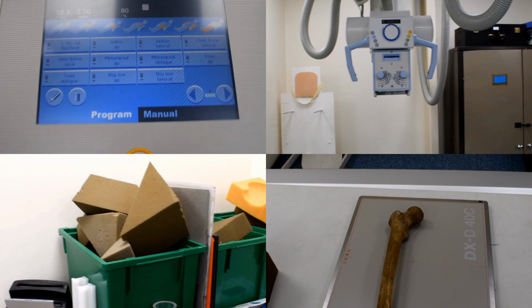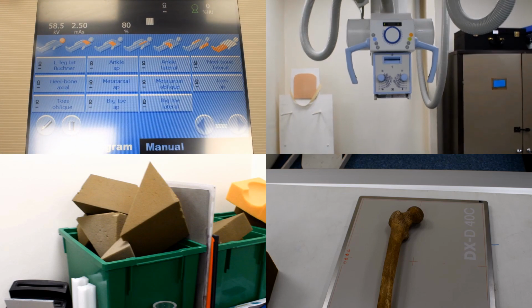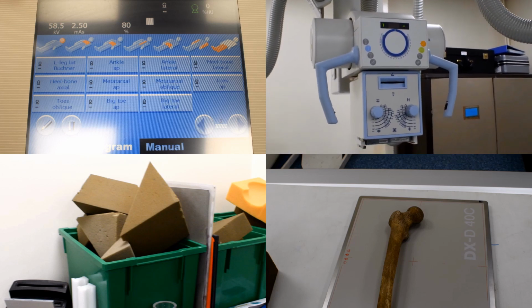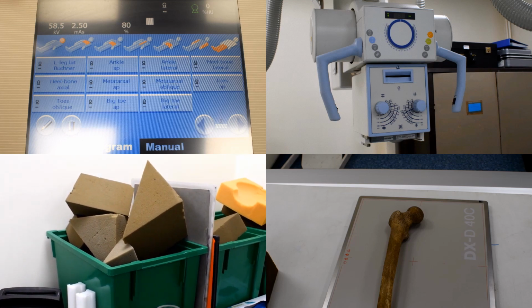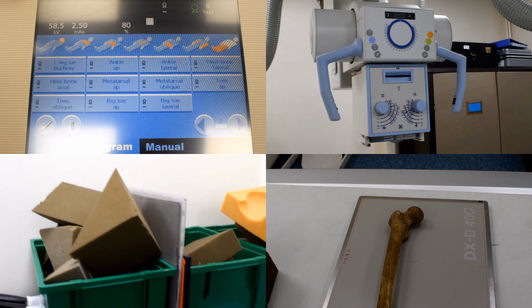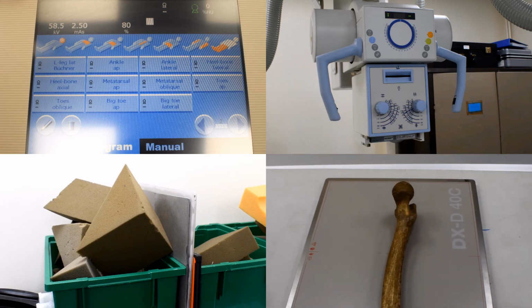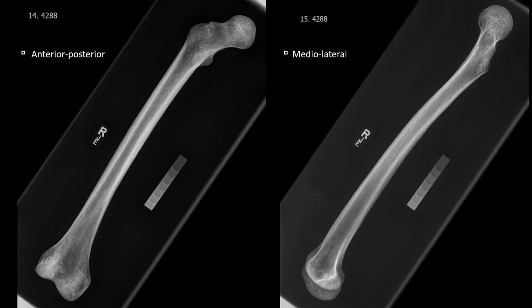And on this slide, we can see the X-ray console, where we would select the exposure values, the X-ray tube, which we would position over the bone, the sponges, which we would use to put the bones into the correct radiographic position, and then lastly, an example bone shown in an anterior, posterior, and a medial lateral position. Just to illustrate the point, these are X-rays of a femur in the anterior, posterior radiographic view, and then the medial lateral view as well.